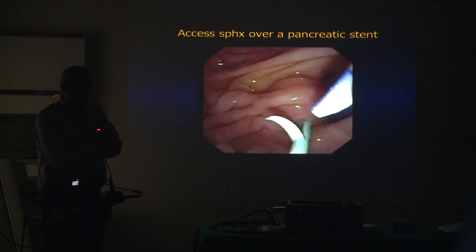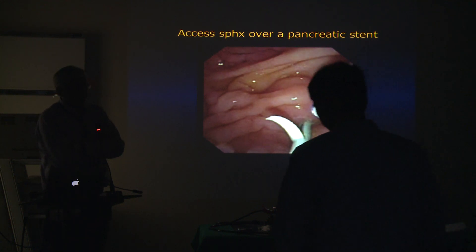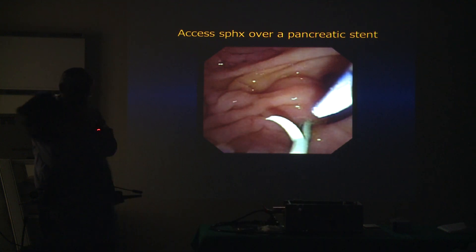I would inject only after I've crossed the stricture with the wire and my cannula is up — then I'm comfortable that I'll be able to drain the system. This is particularly relevant in our practice because we reuse accessories and do things that are not done in the developed world, so we have to keep that in mind.